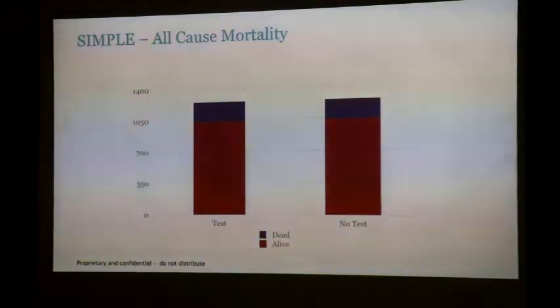If I got a pacemaker lead and poked it into your eyeball, pinned you down, pushed the pacemaker lead in your eyeball, and left it there for 5 minutes, and then measured the resistance, it would be normal. It's all tissue. It's all just fluid, electrolytes. Yeah. It would be normal.